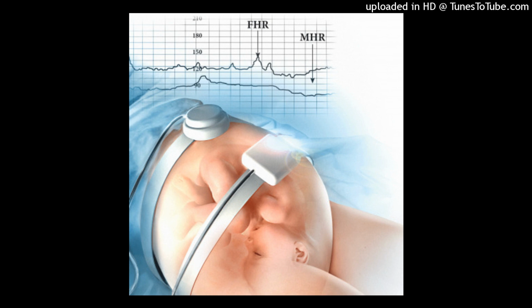Electrodes are applied directly to the fetal presenting part, head or buttocks, and never placed on the fetal genitalia, face, or fontanelles. Each electrode measures, processes, and records the R to R interval in a QRS complex to record the FHR. The opposite end of the electrode is attached to a pad and secured on a woman's thigh or lower abdomen. The cable is attached to the pad and plugged into the fetal monitor, figure 14.6.